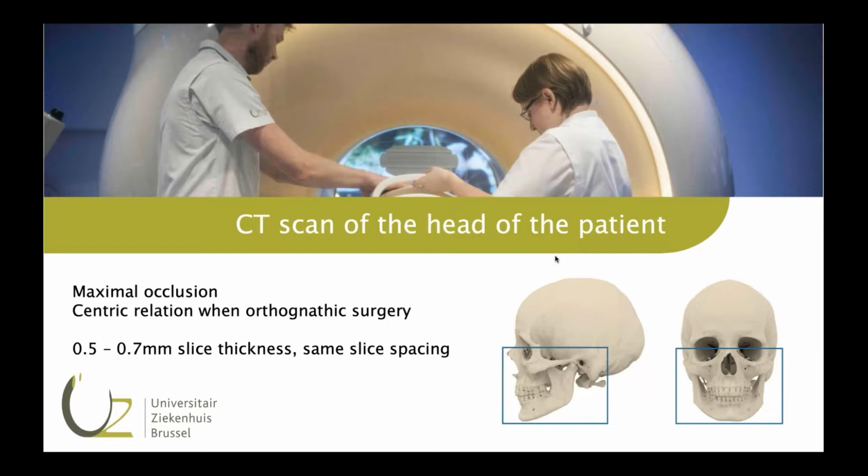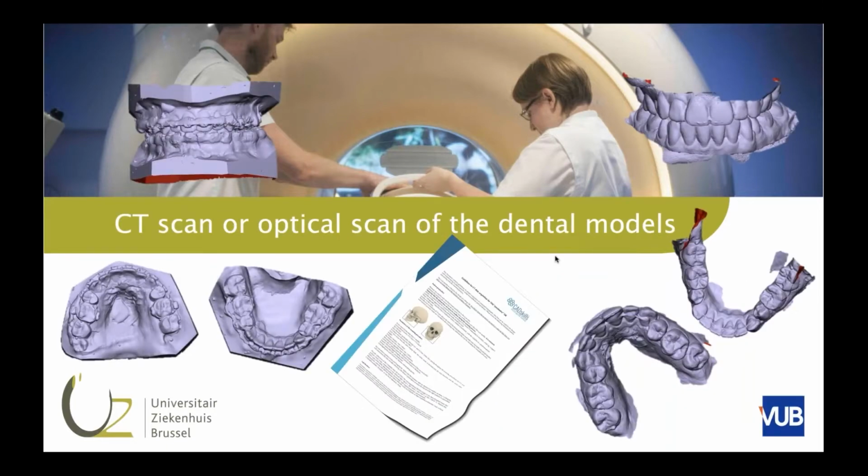The field of view should contain the maxillofacial complex and ask for submillimetric slice thickness and for a cloud-stored DICOM dataset. Only when occlusal corrections are aimed for is the accurate occlusal morphology made available through high-resolution CT scanning or optical scanning. Every company provides written guidelines for the image acquisition.